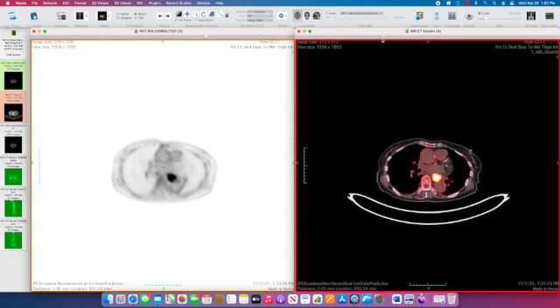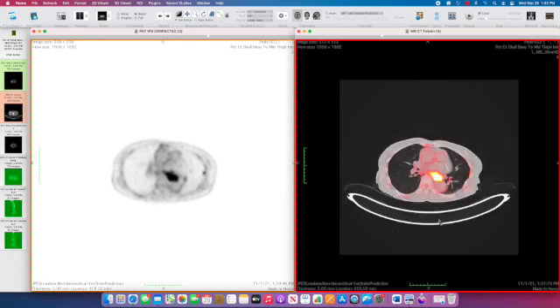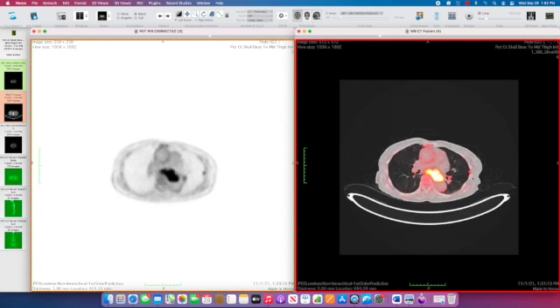Some of you who have eagle eyes may have noticed there's some additional foci of radiotracer activity in the lungs. And if we window to the lungs, which I recommend using the numbers one through four, there actually are some small lung nodules in this patient with mild FDG activity.